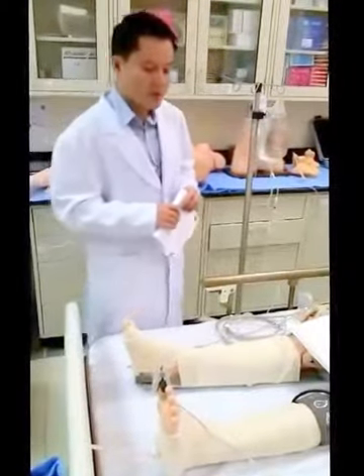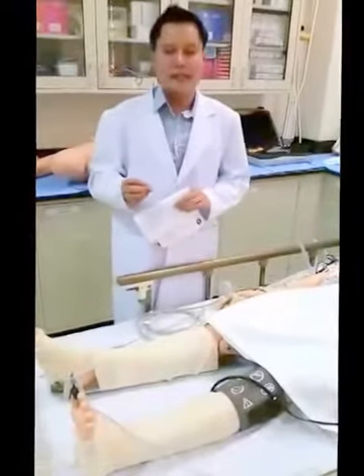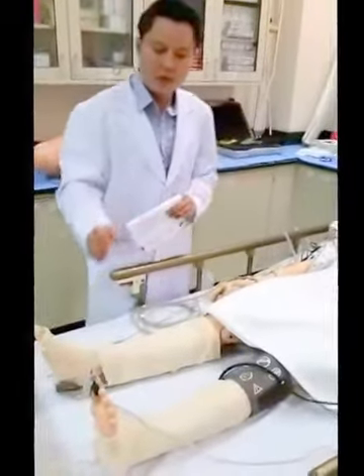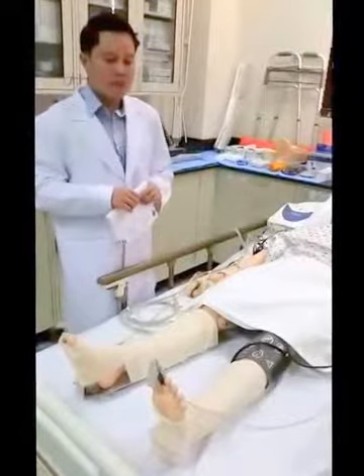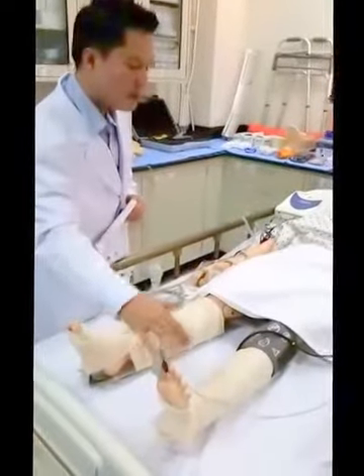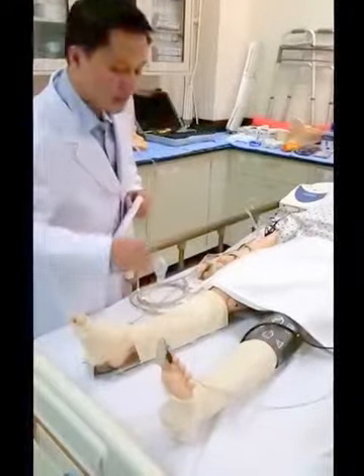Another parameter would be the movement or mobility. So you have to ask the patient to move his toes. So he should be able to move the toes. So if there is a problem after you have attached the skin traction, maybe there is nerve damage, and you will not be able to move the toes.